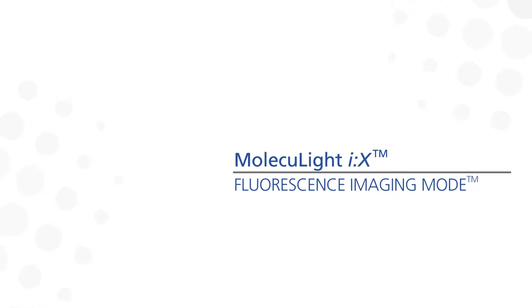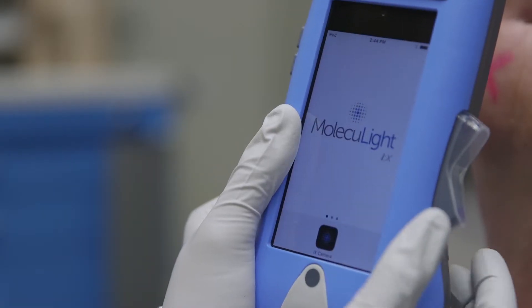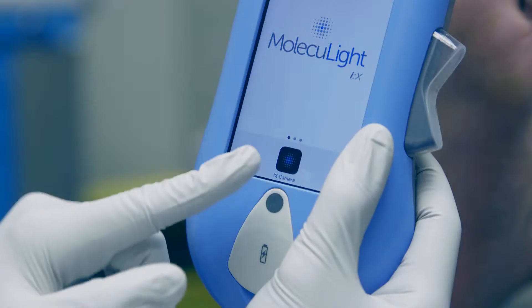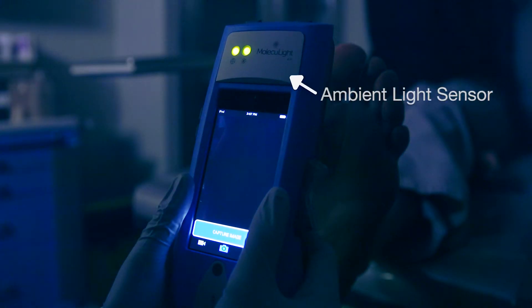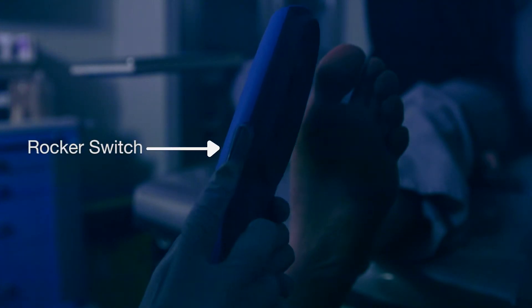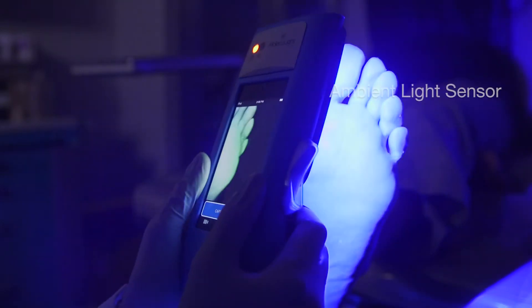Taking a fluorescence light image is quite similar to taking a standard light image. First, press the home button to turn on the display screen. Then slide the slider and select the iX camera app. But now, turn the room lights off. Check the ambient light sensor LED beside the target you were preparing to image. When it's green, the light is optimal, meaning it's dark enough for fluorescence light imaging. Press the rocker switch down, and you'll see the ambient light sensor turns off.